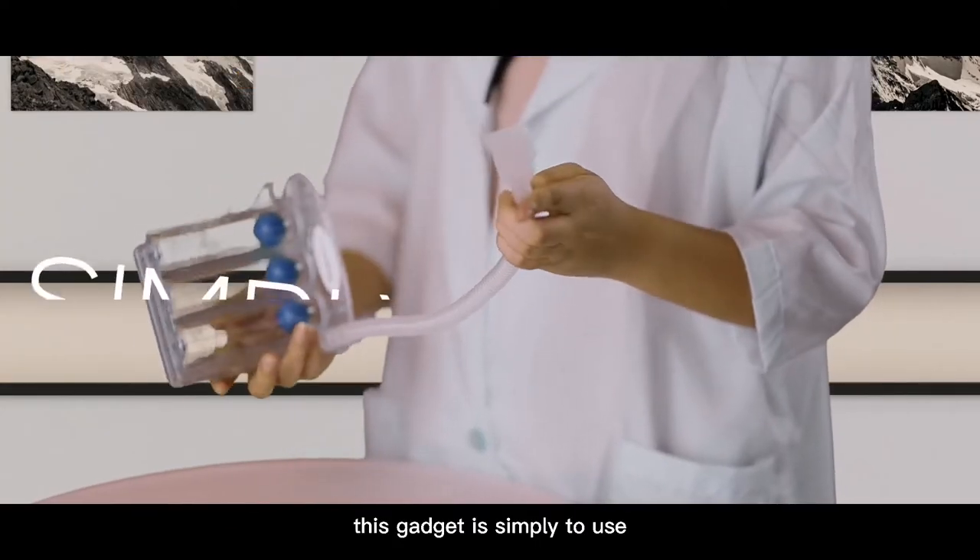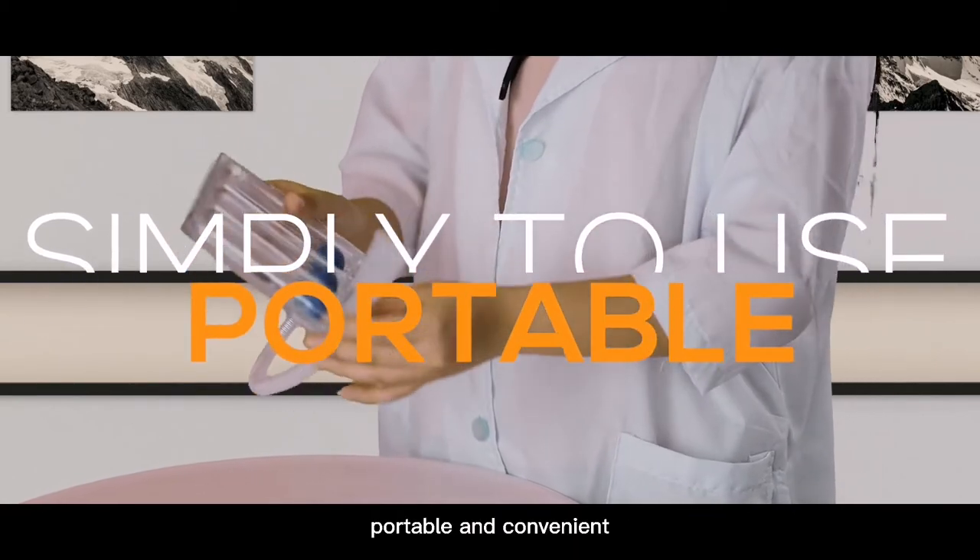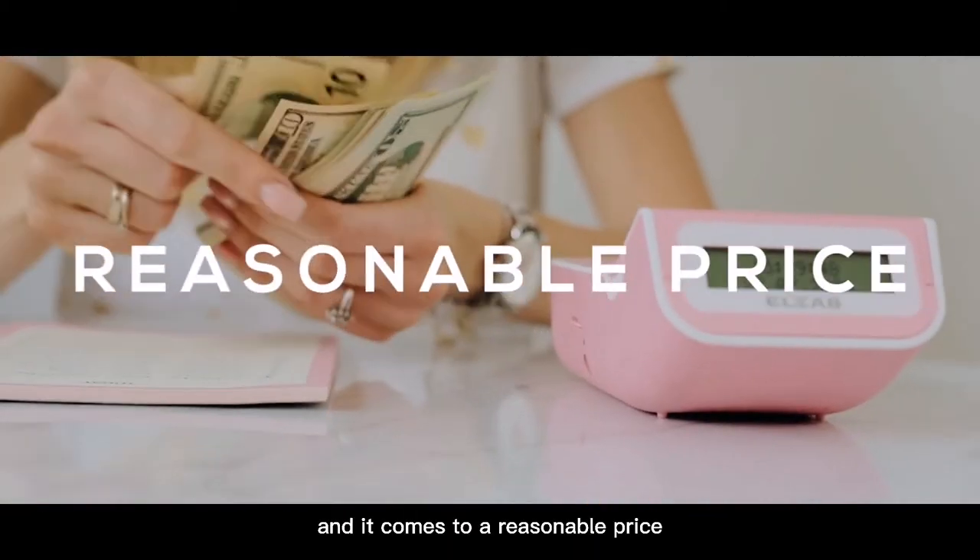This gadget is simple to use, portable, and convenient, and it comes at a reasonable price.